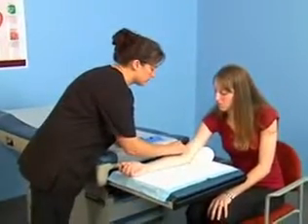Cleanse the puncture site with an antiseptic wipe, moving in a circular motion, starting from the inside and moving away from the puncture site. Allow the site to air dry. This gives the alcohol enough time to destroy the microorganisms on the skin and prevents the patient from experiencing a stinging sensation when the puncture is made.